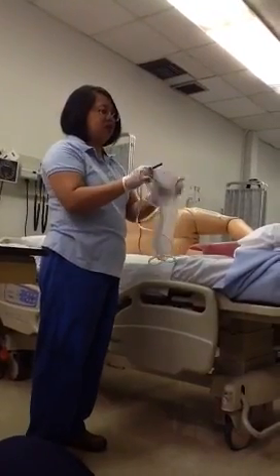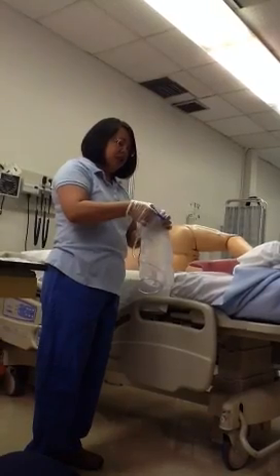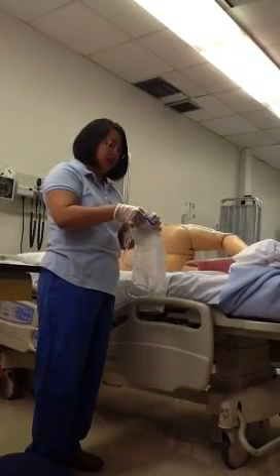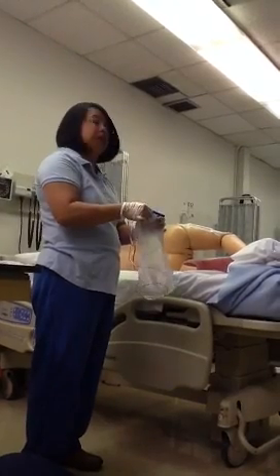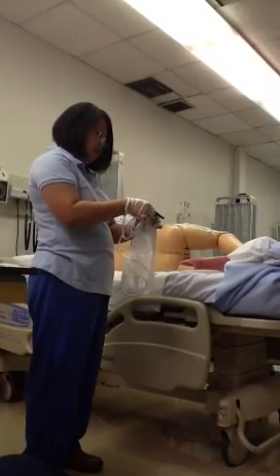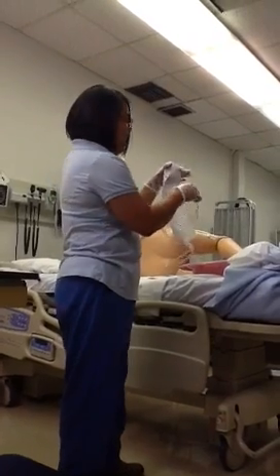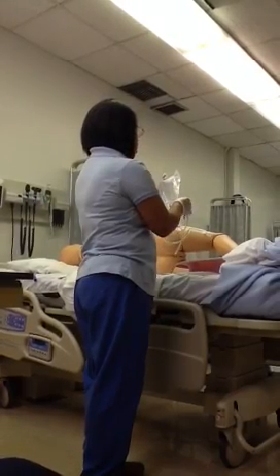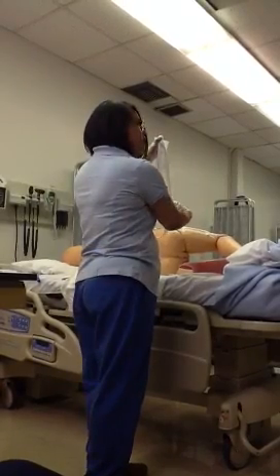And then the second thing you're going to do, you're going to go over to the sink that's in the patient's room, and then you're going to open up the top, and you're going to get warm water. I don't know, there's even a temperature that the book states. I think it's like 105, 110, whatever. If it's warm on your arm, then it's warm enough to be in his rectum. Okay? So you're going to open this up, and then you're going to fill this up to whatever the doctor wants. Say that he wants it to 500. On this particular bag, right on the edge, it is marked 500, 1,000. This one actually says 1,500, okay? So you want to fill it up to the 500 mark.